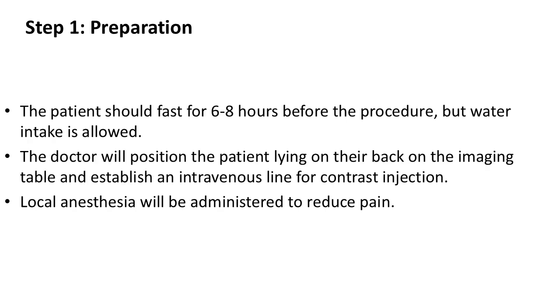The patient should fast for 6 to 8 hours before the procedure, but water intake is allowed. The doctor will position the patient lying on their back on the imaging table and establish an intravenous line for contrast injection. Local anesthesia will be administered to reduce pain.